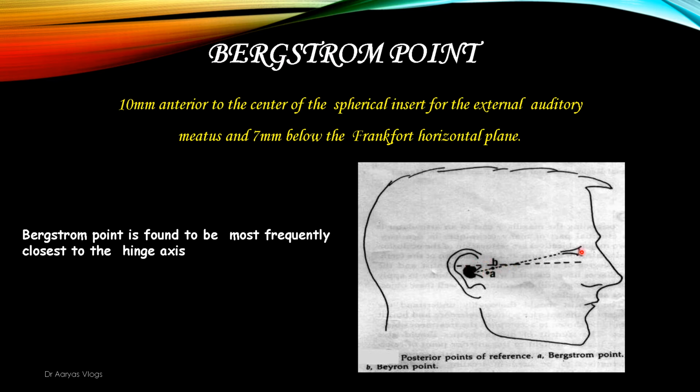It is found to be most frequently closest to the hinge axis. So this is the Bergstrom point.